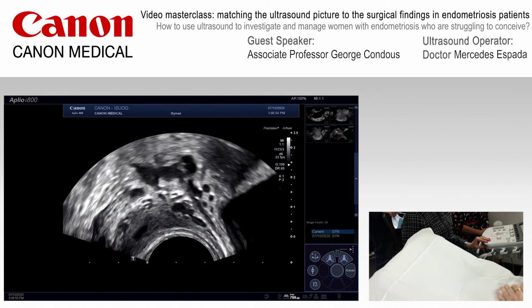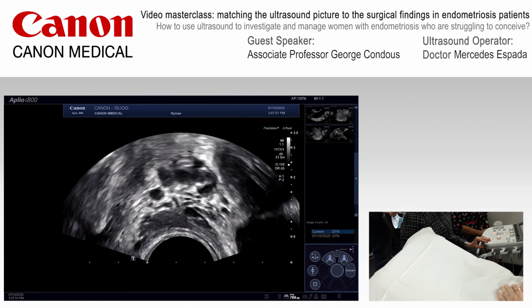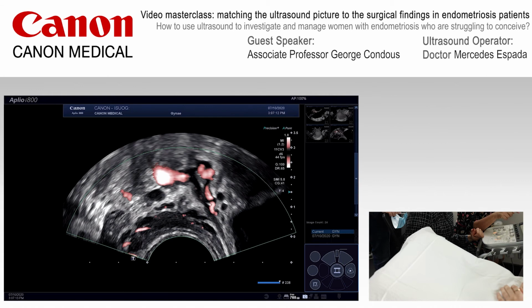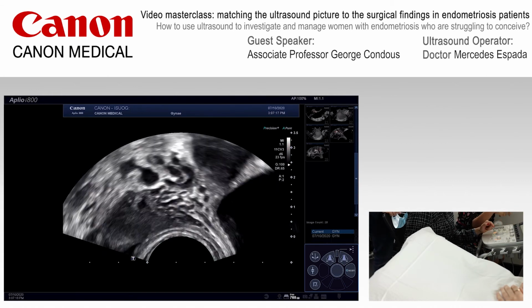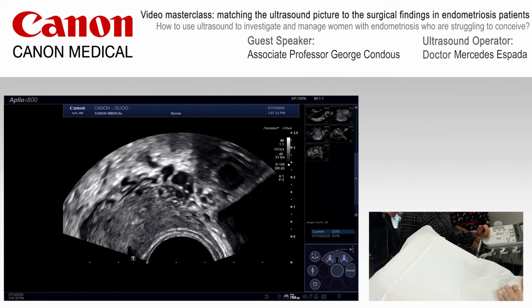And we can see quite nicely there that the bladder abutting the uterus is the base of the bladder. Preferentially, if there are any deep endometriotic lesions of the bladder, they tend to be within the bladder base itself. But we can see quite clearly here that the bladder base looks free of disease. What we usually do to visualize the ureter is we reverse and invert the image. That's great. So now we're in an anatomical situation.